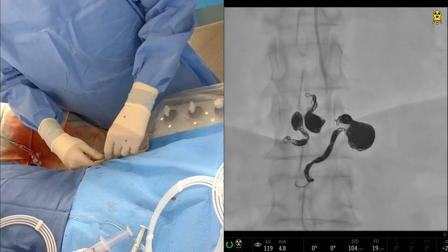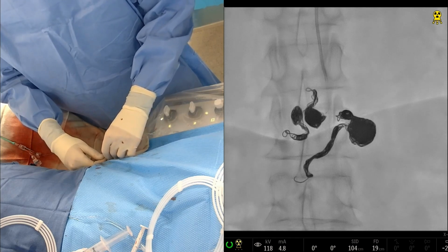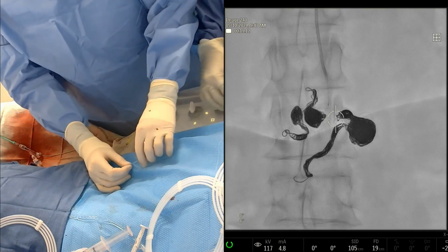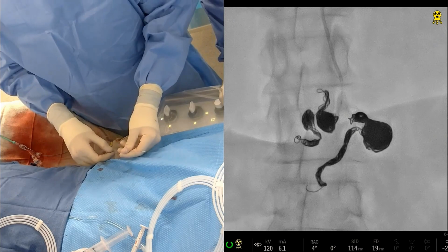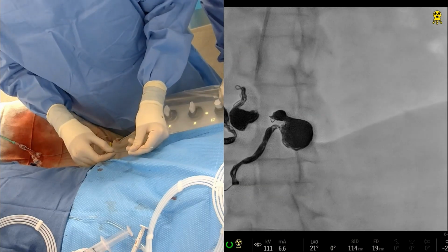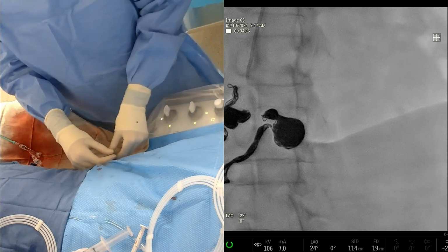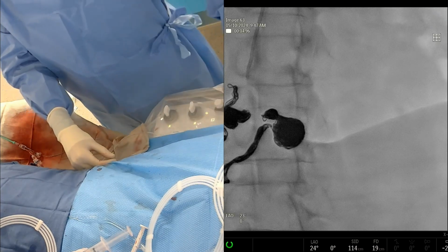No, I think it's starting to poke out into that inflow vessel. I think you wouldn't have gotten away with the packing there. I think it's a good choice. Maybe a 5? What do you think? A 520? Do we have a 520 or is it a 515? I can't remember. Do we have like a 520?